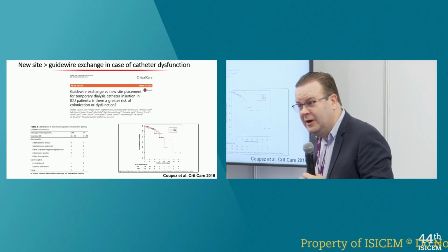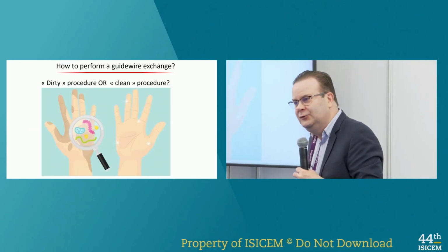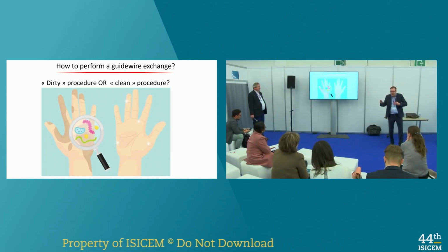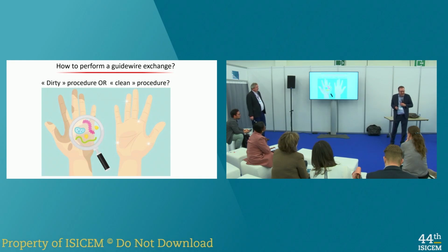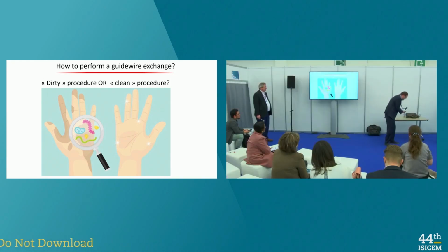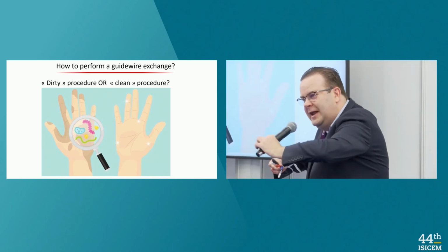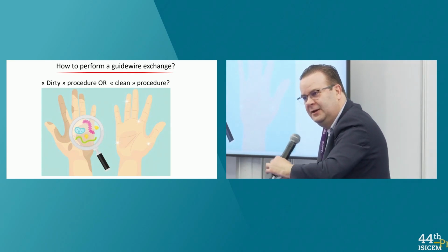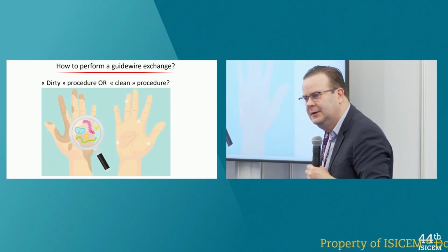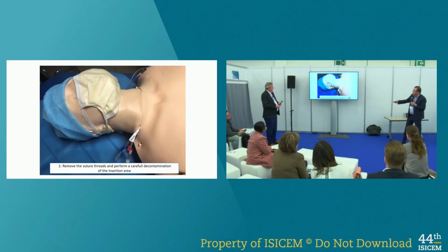But a guide wire exchange, you have to do it in a clean way, right? Because you have two techniques to do the guide wire exchange. One is clean, one is dirty. And I think when I was a fellow, I was doing the dirty thing. You put your guide wire in here, it's dirty, right? So if you put a sterile guide wire here, you take the bacteria here and you put them inside the body. Not so good. So there is a clean way. Look, you have your catheter here.